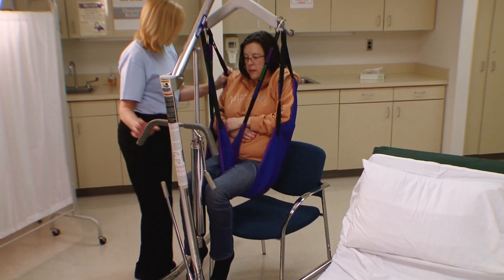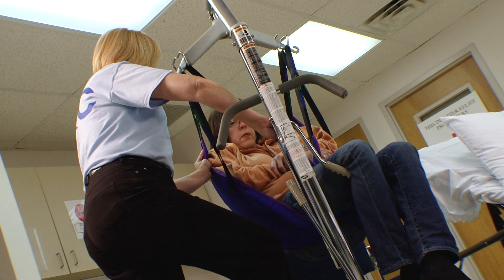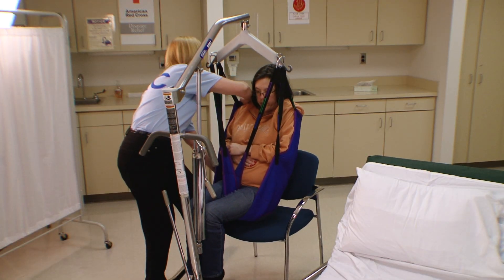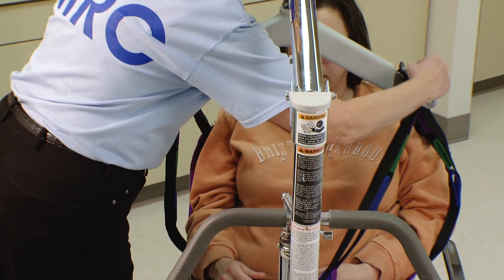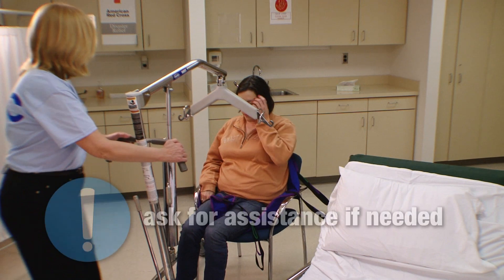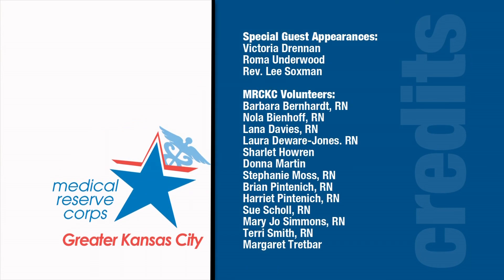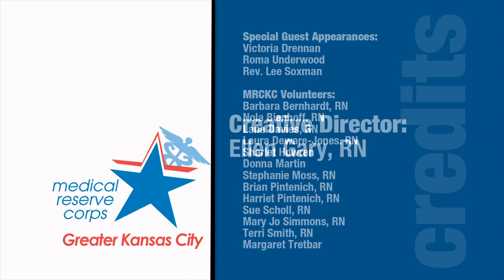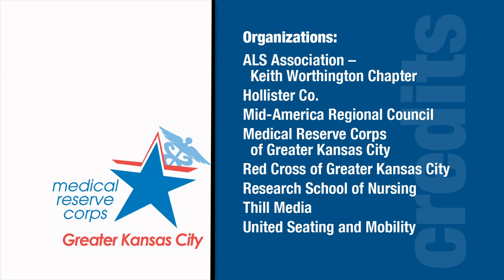After the individual is positioned over the chair, slowly turn the valve to the left and lower the individual to the chair. Help to guide the individual into a good upright position as their weight is being lowered. Detach the loops from the cradle and let the tails rest in the person's lap. Move the lifter away. Ask for assistance from the nurse in charge if needed.